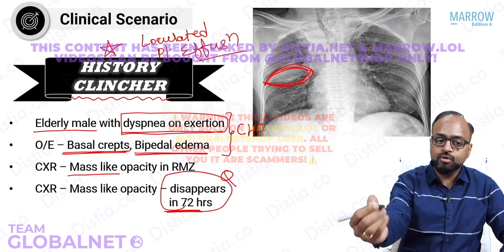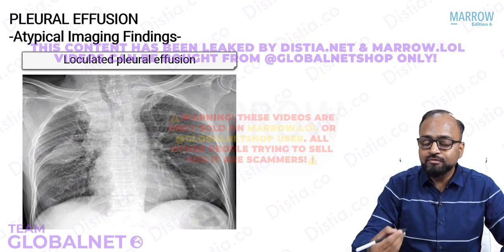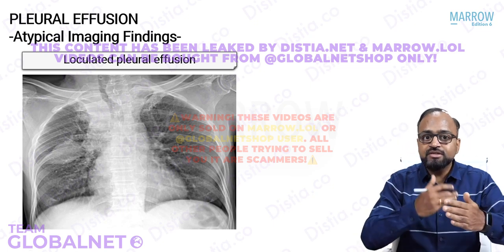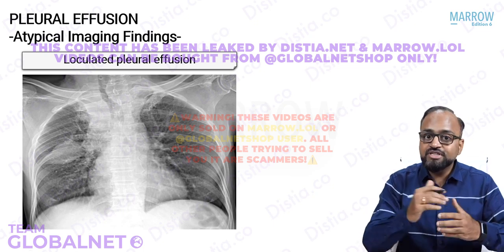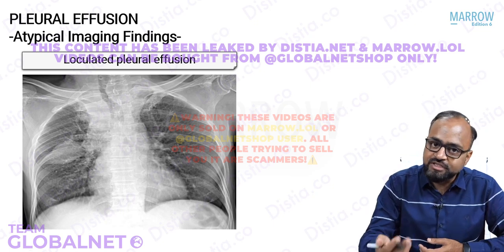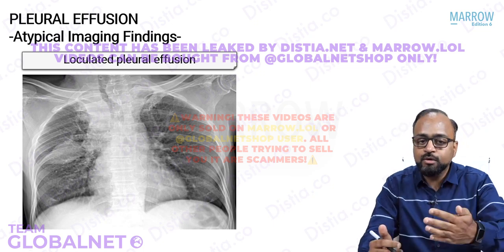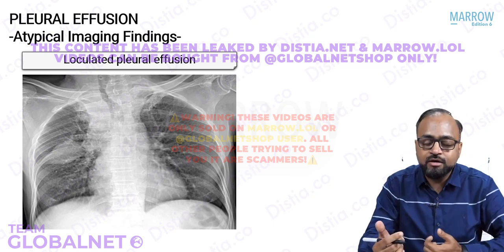So what is this loculated pleural effusion? Let us have a look. Now see, until now I have told you that whenever fluid accumulates in the pleural cavity, it is a free collection of fluid. So the fluid settles down to the dependent part. With the change in patient position, as the dependent position of the pleural cavity changes, the appearance of the pleural fluid or pleural effusion also changes. So we started with blunting, meniscus, whiteout lung. Supine, the appearance is different. Lateral decubitus, it layers down along the lateral wall.